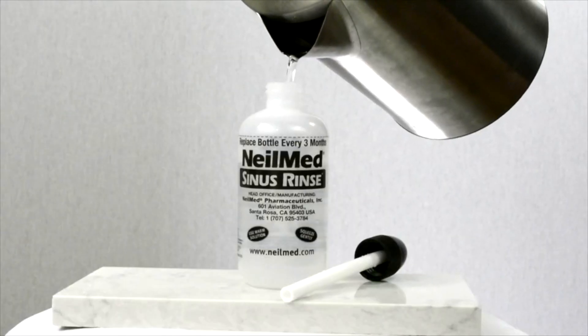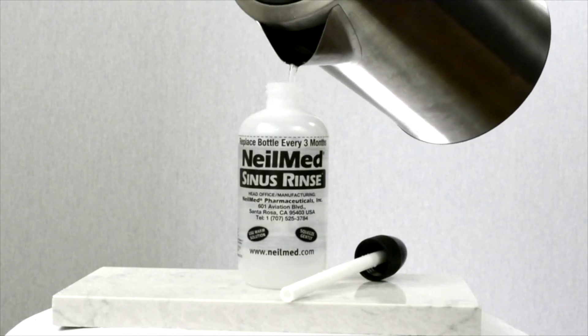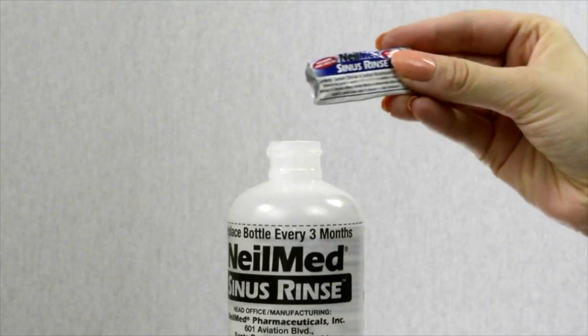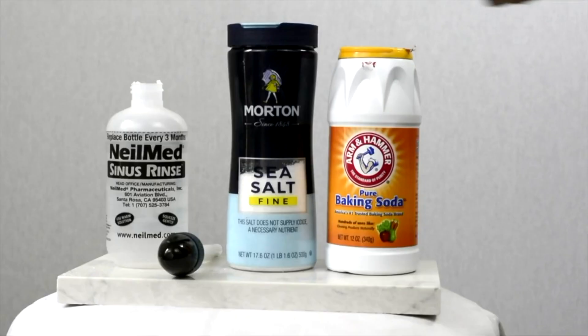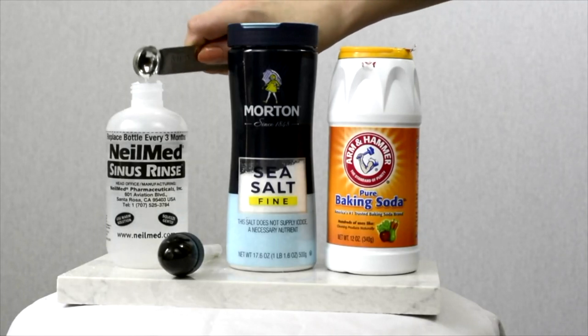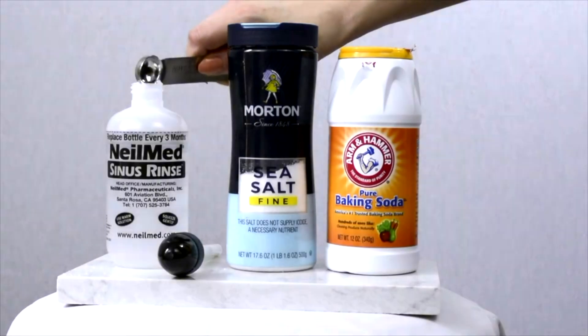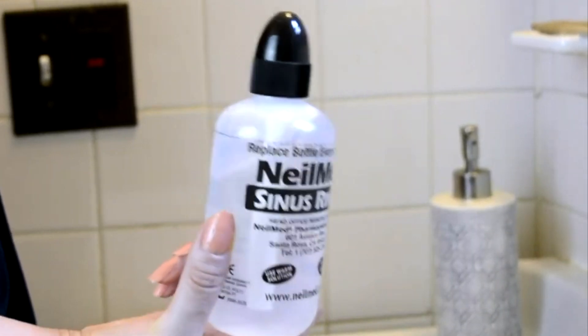First, fill the bottle to the line with lukewarm distilled water or previously boiled water. Mix in one pre-measured salt packet. As a substitute, you can add one half teaspoon of salt and one half teaspoon of baking soda. Give the bottle a swirl, making sure to dissolve everything.